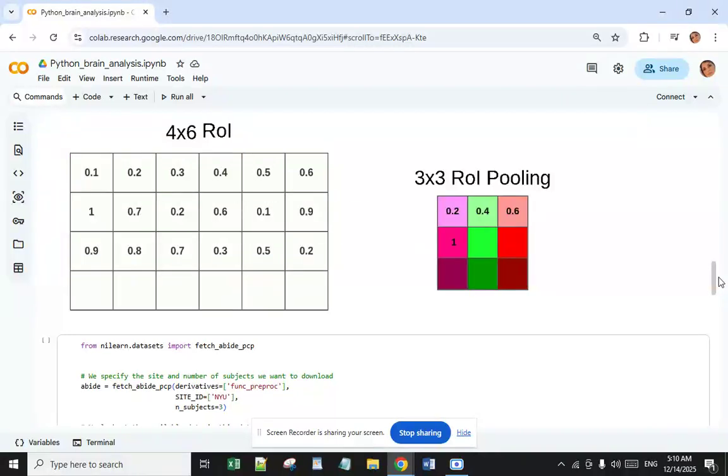However, applying cascaded convolution or cross-correlation kernels, only 25 weights for each convolutional layer are required to process 5 multiplied by 5 size tiles. Higher layer features are extracted from wider context windows compared to lower layer features.